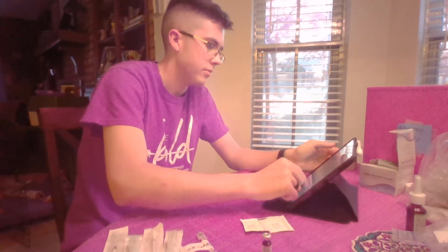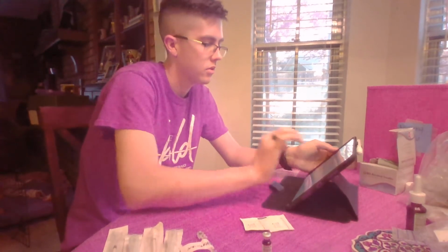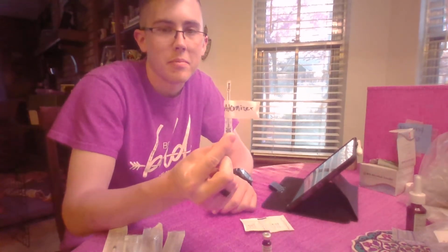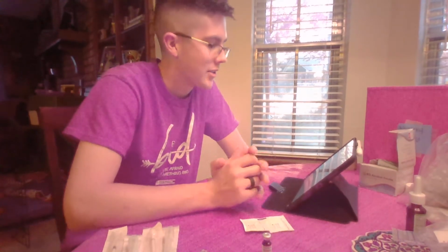Okay, so sorry, I had the wrong one pulled up. So struggling to find an atomizer. I kind of made a makeshift one, so this is going to be my atomizer that I have.